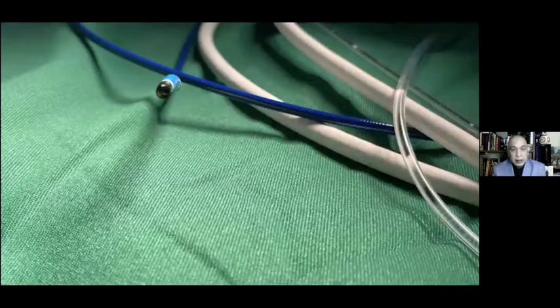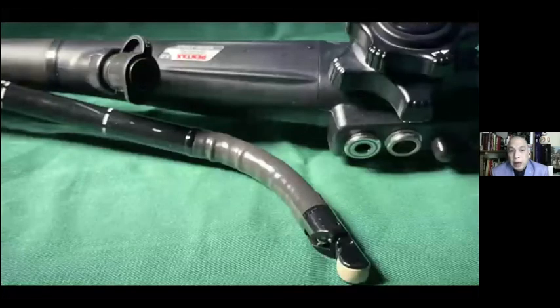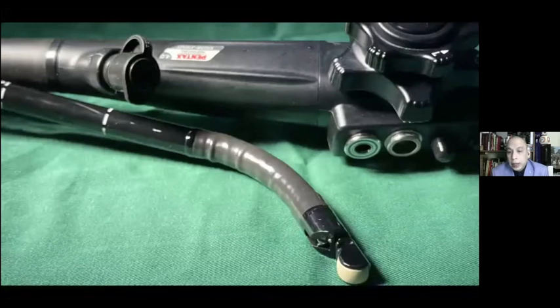This is a SpyGlass, a small 10 French cholangioscope that can be used independently as a scope or as part of a mother-baby scope system for biliary endoscopy. I'll show you some videos later. This is how an echoendoscope would look, a linear echoendoscope. This is the only echoendoscope that we use in our unit, because having a radial echoendoscope and other intraductal echoendoscopes might be very expensive for the unit to buy.